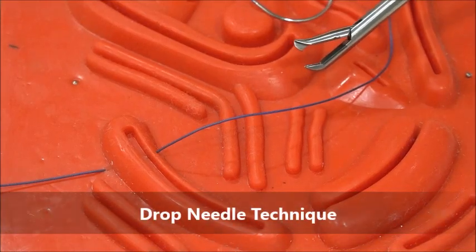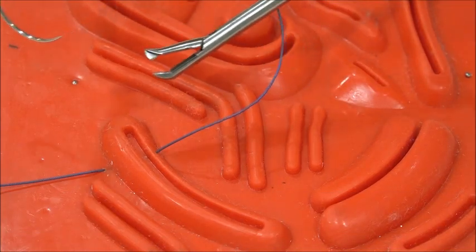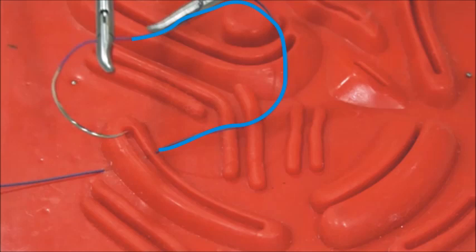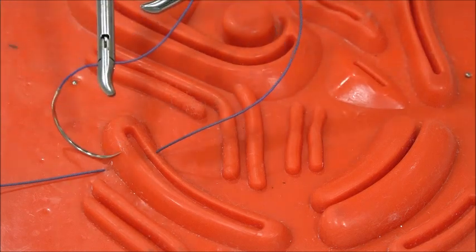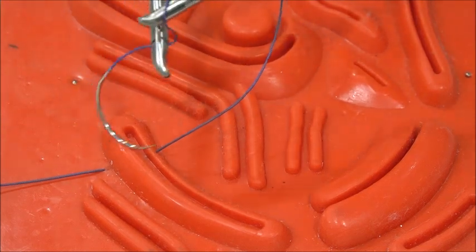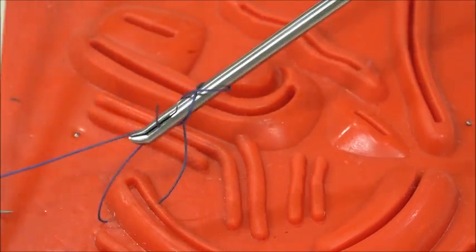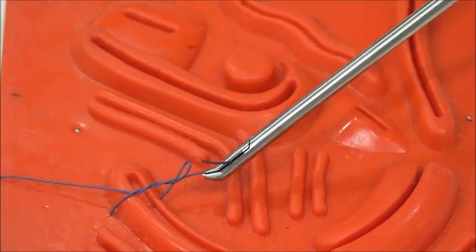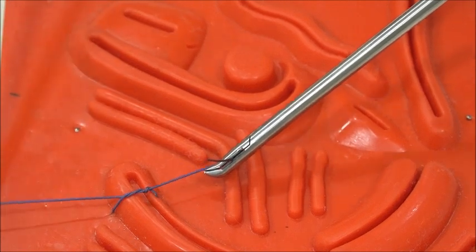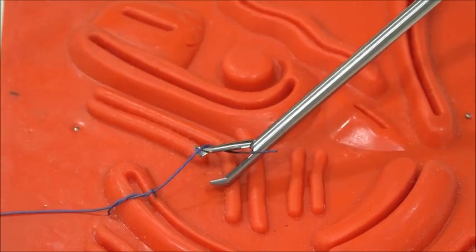Knot tying: there are two techniques of knot tying—drop needle technique and hold needle technique. In drop needle technique, hold with the right grasper 2 cm distal to the base. The left instrument is constant. Two wraps are taken, and the left instrument holds the tail. You should not pull the tail, and the two threads are tied parallel to the tissue.